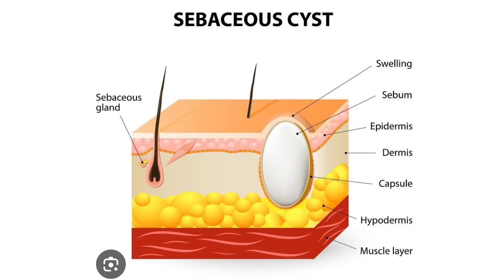Look at this image — this is a sebaceous cyst. Sebaceous glands are usually found in the dermis, and if blocked with sebum or keratin, it swells up. You can appreciate the swelling, and inside you can see the sebum. The epidermis layer is visible, then the dermis is visible. This cyst is predominantly arising from the dermal layer and has its own capsule. Below there is hypodermis and muscle layer.